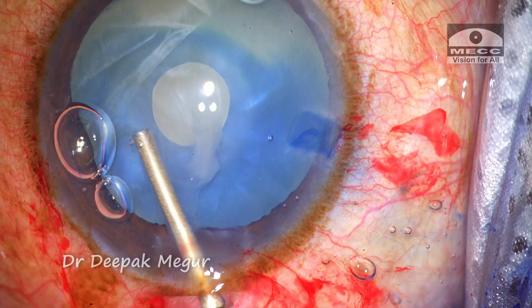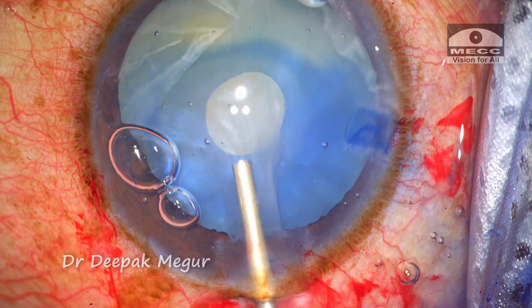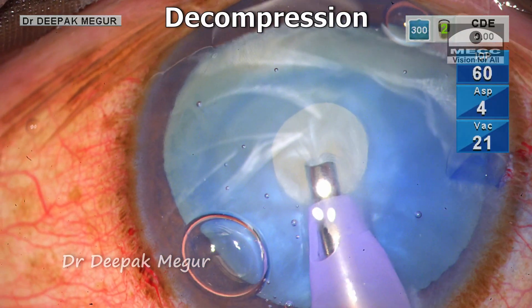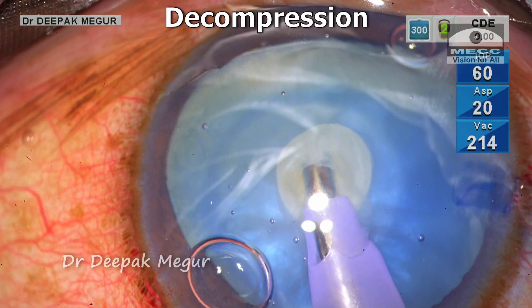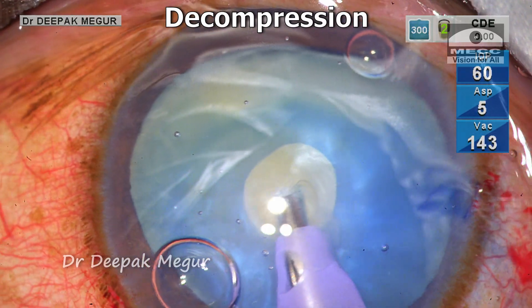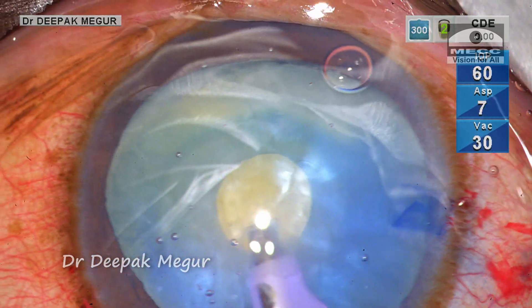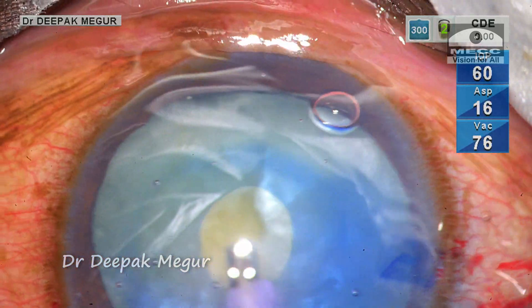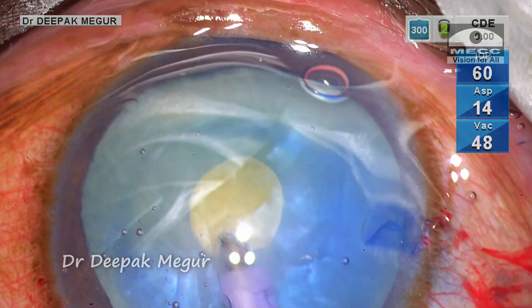In spite of having used dispersive OVD, the shallow anterior chamber in the distal half is quite intimidating. I need to decompress the capsular bag and I am using my phaco tip to do the same. The machine is set in cortex mode.